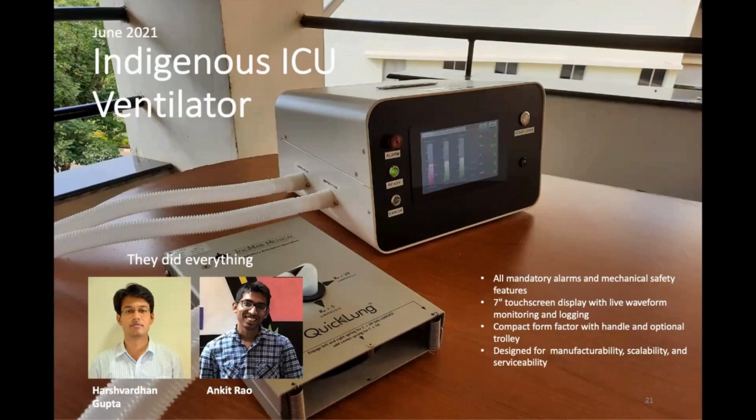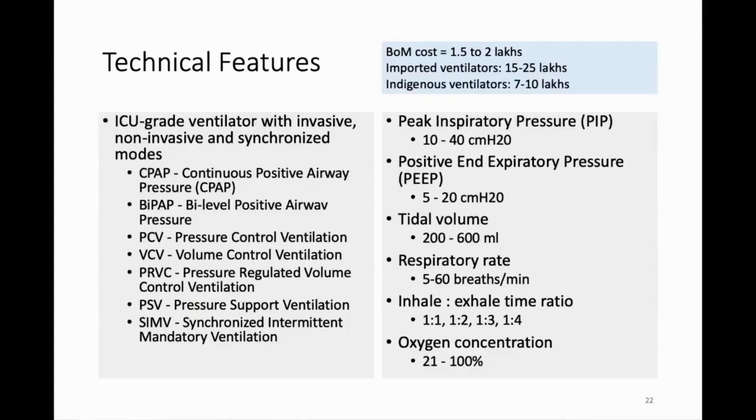But finally, we had a system that had all the mandatory alarms, all the mechanical safety, a touch screen that doctors can actually use, a compact form factor, and it has actually been designed for manufacturability, scalability, and serviceability. These are the technical features. If you're not in the medical field, this may not make much sense. So let's ignore those. Let's look at the cost, what we ended up finally getting made.